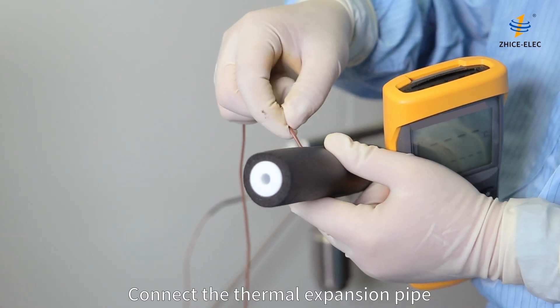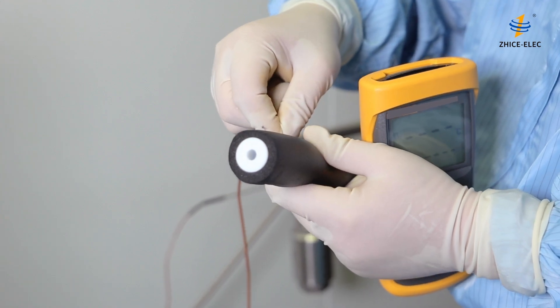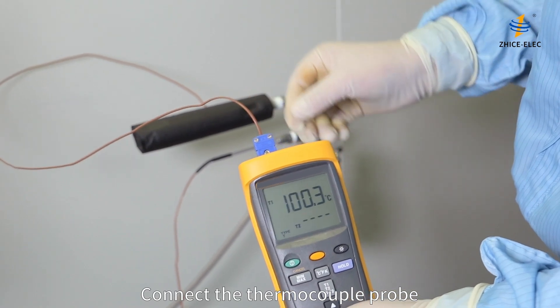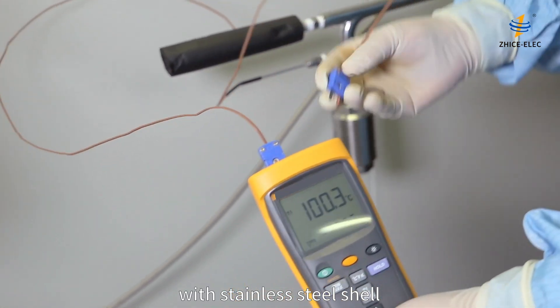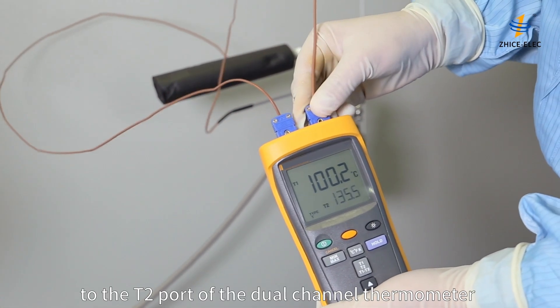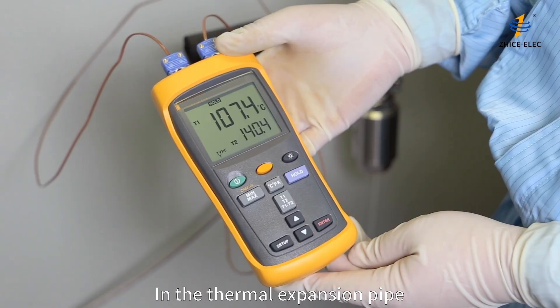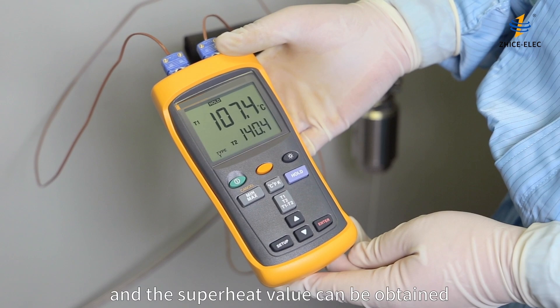Connect the thermal expansion pipe with the thermocouple to the pitot tube. Connect the thermocouple to the T1 port on the dual-channel thermometer. Connect the thermocouple probe with the stainless steel shell to the T2 port of the dual-channel thermometer. In the thermal expansion pipe, the temperature value of pure steam at local atmospheric pressure is measured, and the superheat value can be obtained by subtracting the boiling point at local atmospheric pressure from the measured temperature value.